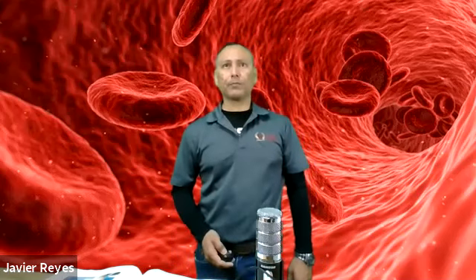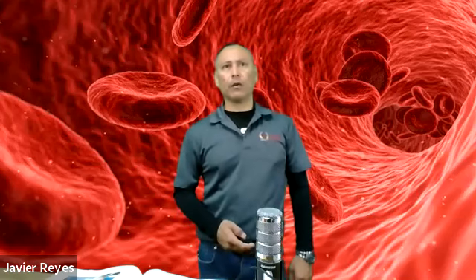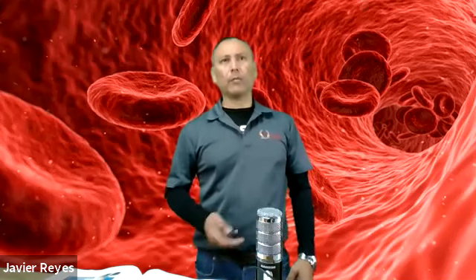We have kids that have a risk of cardiac arrest because of the low blood volume. You can perform capillary punctures. In this case, you may perform either heel punctures or maybe finger punctures. When venipunctures are very difficult, it may damage the veins or other tissue around them. If the deep veins are hemorrhaging, have blood clots or infections, or when the risk outweighs the benefits, we prefer to go with a capillary puncture whenever possible.